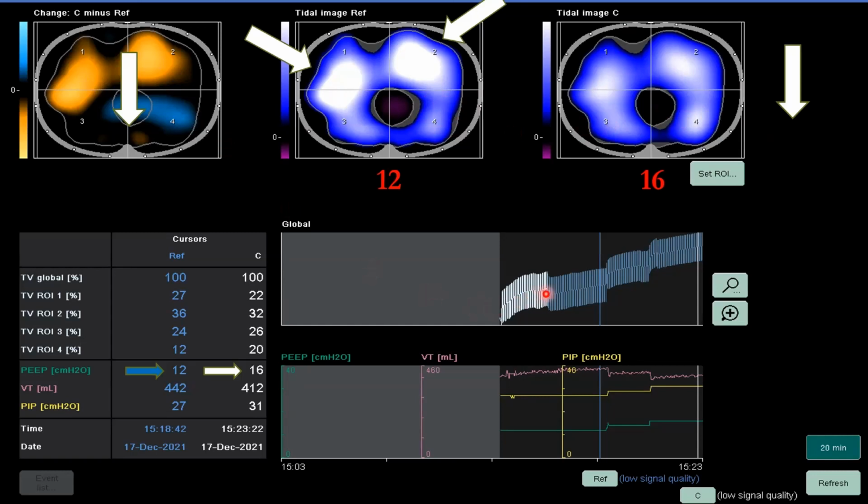We see the impedance curves going up, and we have 12% distributed over here to this region, and we were able to increase this region here to 20. So you notice here, we're not doing it in layers, we're actually doing this one in quadrants. We see the upward trajectory here, saying that we're recruiting functional residual capacity. And to be honest, we see this even just with the 12 going up here. We could have been patient and waited for this recruitment to happen on 12 completely to straighten out, and then after go to the next one.